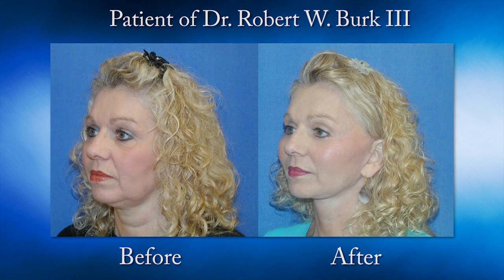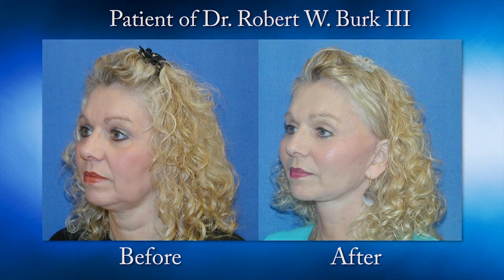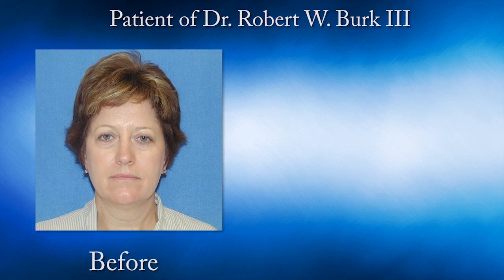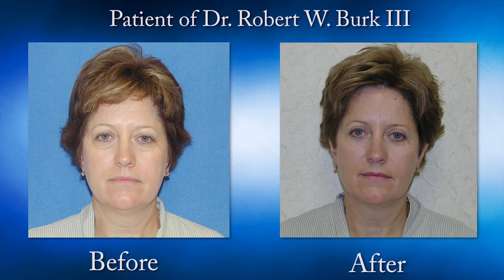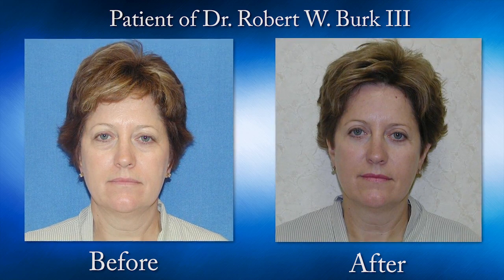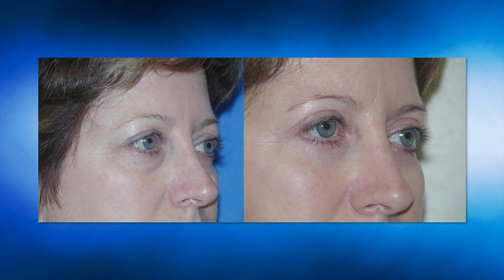Here is the typical patient with the midface cheek device placed through the scalp incision. Certainly all facial rejuvenation is subject to aging that occurs with time, but the elevation that we see with the cheek is really very long lasting. It probably stays up in that position for about 8 to 10 years. And as the patient continues to age, it's going to look natural. It's not going to look unnatural or unusual. It's going to be subject to the same facial aging that occurred before the surgery.